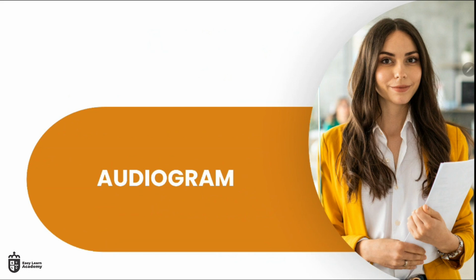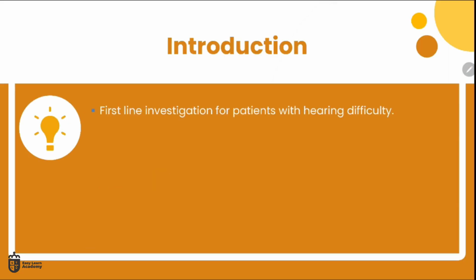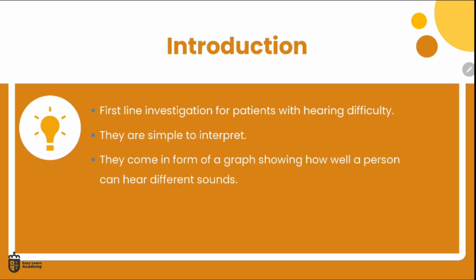Now, if you don't understand anything, please feel free to ask me. You can stop me in between, and then I can go through again, or we can have a chat about the area where you are struggling with the audiogram. So, looking at this, the audiogram will definitely be an investigation for people with hearing difficulty, which I know most of you know, and they are very simple to interpret.